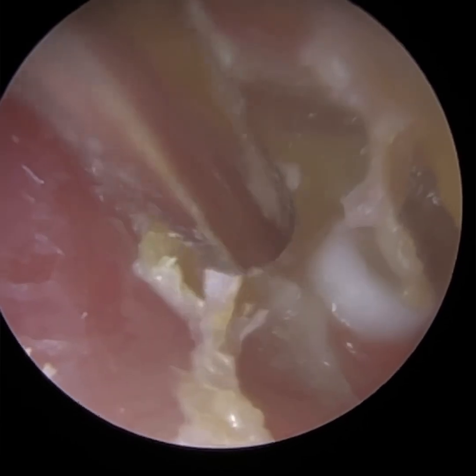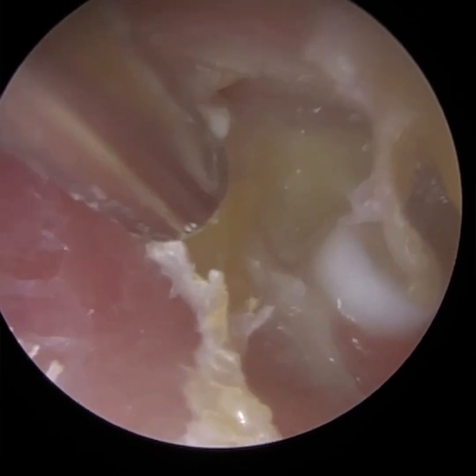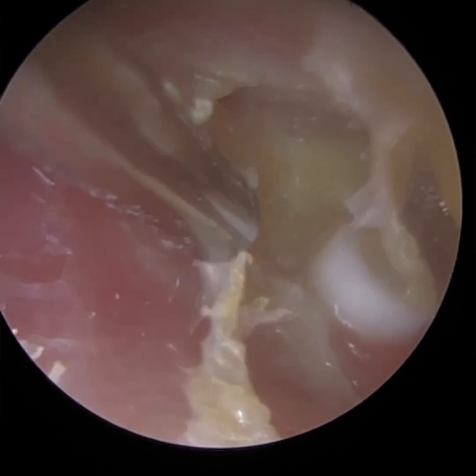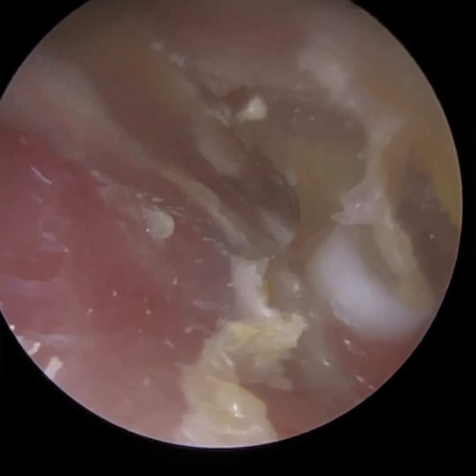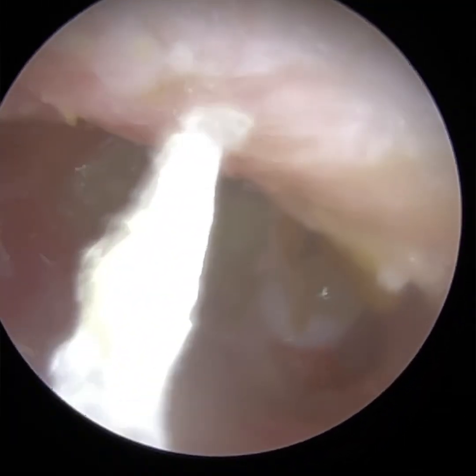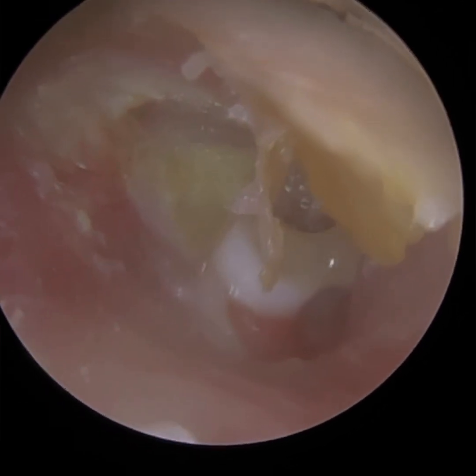Now, this grommet has probably been in there for a year. Normally, it falls out between 6 and 12 months, and we hope that during that time, whatever's causing the eustachian tube obstruction will resolve. Especially in children, because it's quite common in children growing up, the eustachian tube is narrow just because of their age. It also has a more horizontal orientation, so gravity doesn't really work well. As we get older, the eustachian tube widens a little bit, and it reorientates, it becomes more vertical. And when it's more vertical, any fluid that accumulates is more likely to drain out because of gravity.